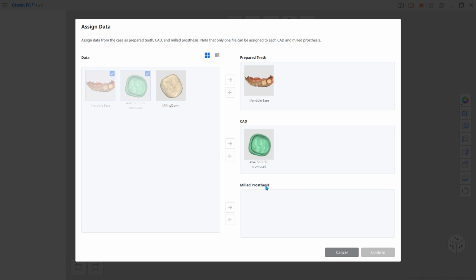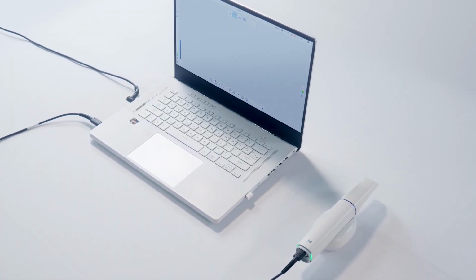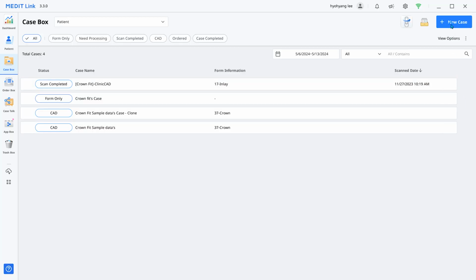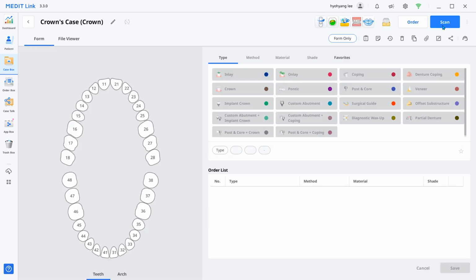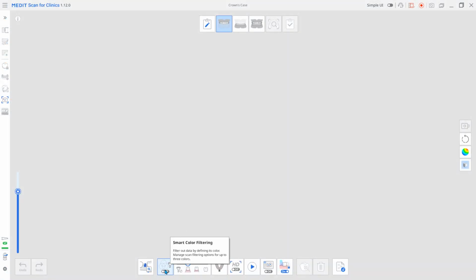This video will explain how to scan a milled prosthesis quickly and conveniently using a Medit intraoral scanner and the Medit Scan for Clinics software. First, create a new case for the scan in Medit link, then run Medit Scan for Clinics. Before scanning, click the Smart Color Filtering option and register the glove color to be filtered out.